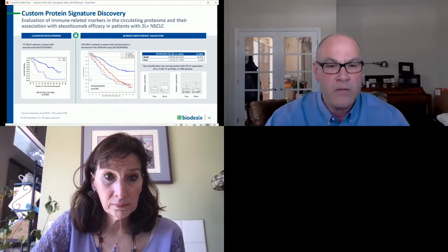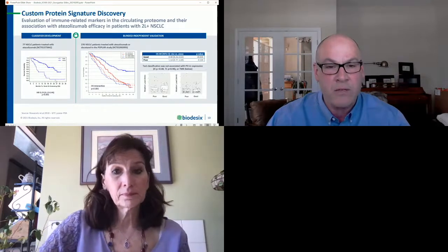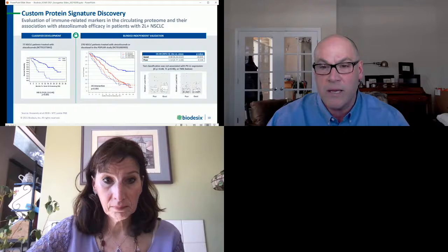A really good example of that is some work that we did with Genentech for their asset atezolizumab, where we started with 77 non-small cell lung cancer patients and developed a test that predicted those patients that would respond versus those that wouldn't. At that point, we locked the algorithm and took that to a blinded independent validation, where we were able to recapitulate that data, looking at the solid lines here, where we see a large difference between the responders to atezolizumab versus those that don't. We were able to show in this study as well that it was predictive for atezolizumab because it didn't split any chemotherapy arms. Here we're looking at docetaxel, where it didn't do anything prognostic or predictive, nor for any of the other chemotherapies that we tested.